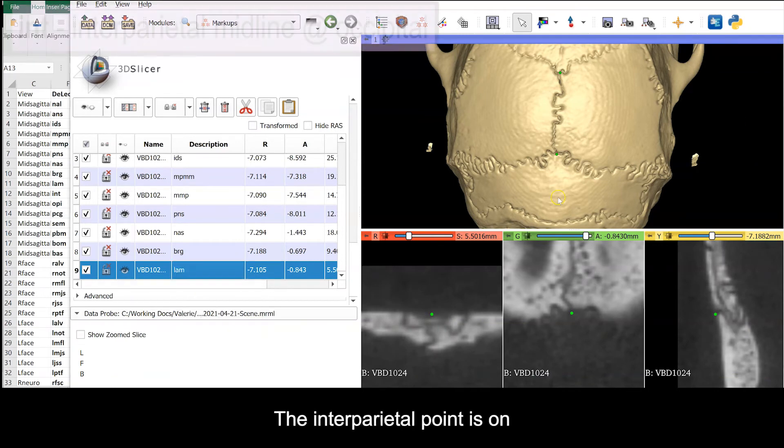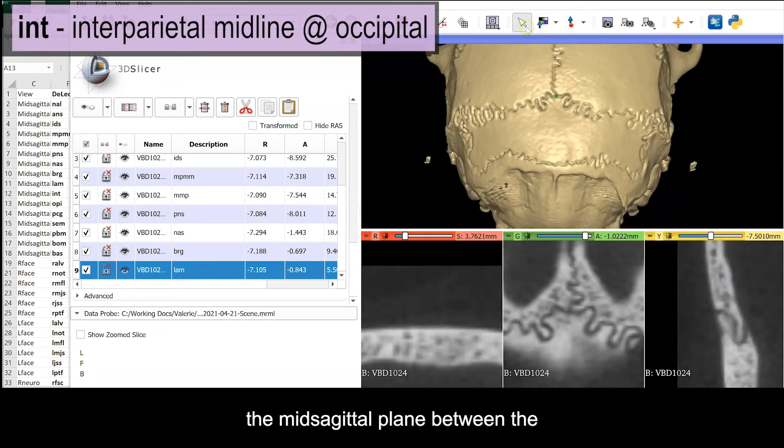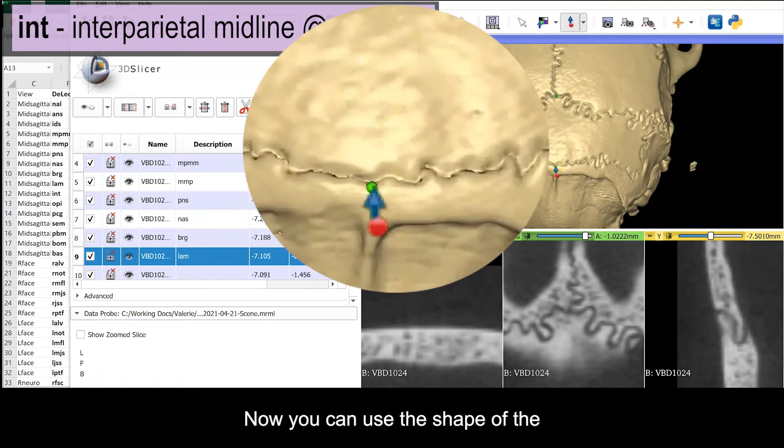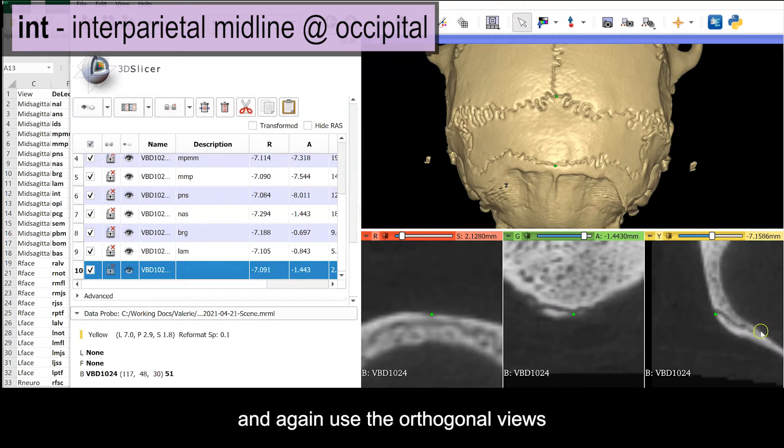The interparietal point is on the mid-sagittal plane between the interparietal and occipital bones. You can use the shape of the nuchal lines to identify the midline, and again use the orthogonal views to confirm that the landmark hasn't fallen into the suture.